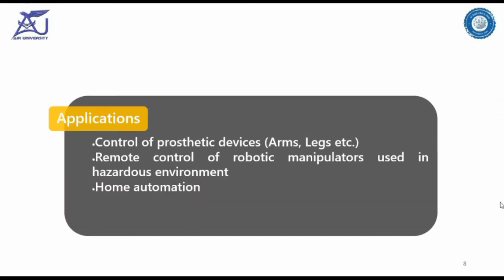Moving on, the applications are not limited to just control of prosthetic devices. We can also use fNIRS for home automation. The NIRS technologies are working on new optodes. They call them bundled optodes. They will cover less area because not all the brain regions are activated for specific activities. So it is really hectic to wear that cap for signal acquisition and control.